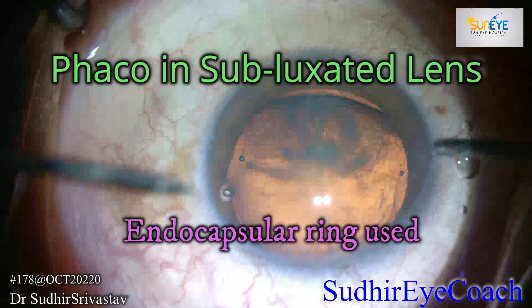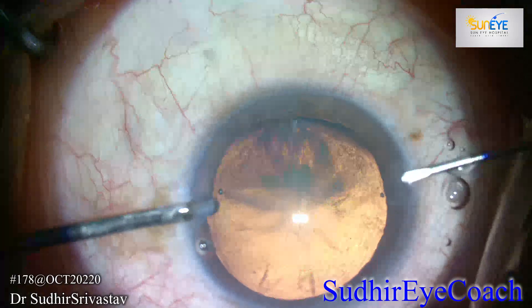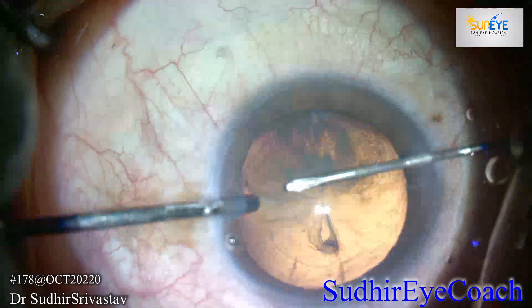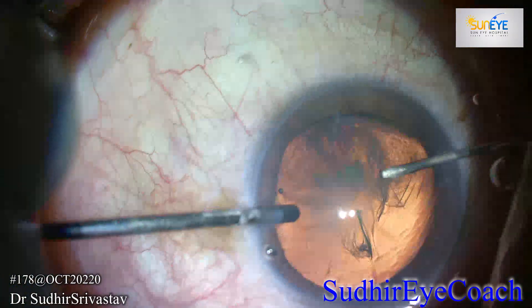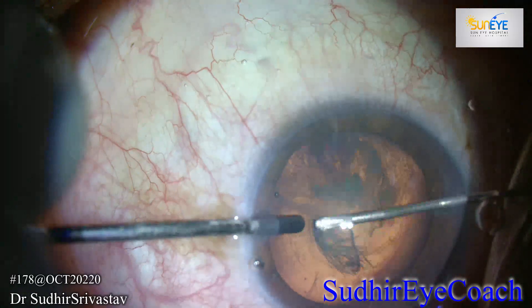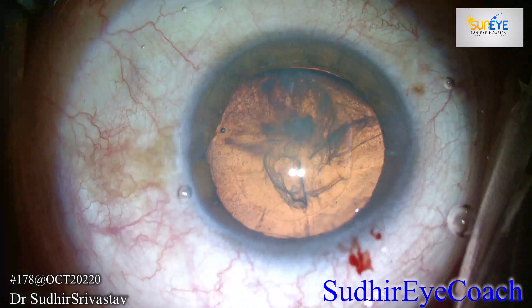Always assess such patients meticulously preoperatively regarding glaucoma, and if possible always try to rule out any existing retinal pathology. If you are not prepared that day, postpone the case and reschedule so that you can prepare every modality in advance before starting this procedure.